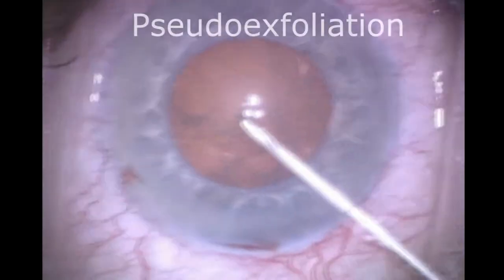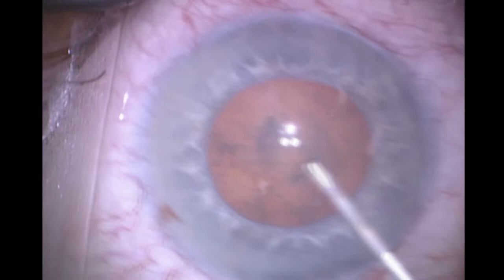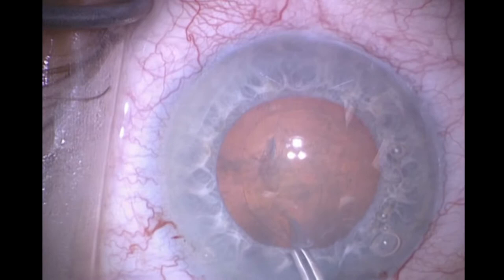This is a case of pseudoexfoliation with a poorly dilating pupil. You can see phacodinesis as I start to initiate the CCC, with quite a lot of lateral displacement of the entire capsular bag. There are folds in the anterior capsule itself showing lack of centrifugal zonular tension, making it very lax.